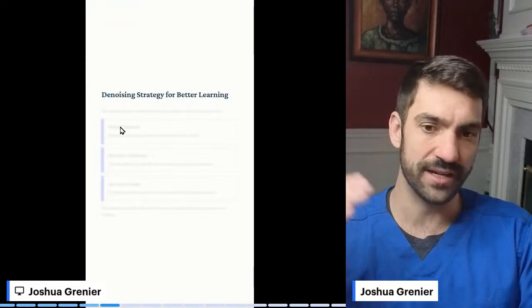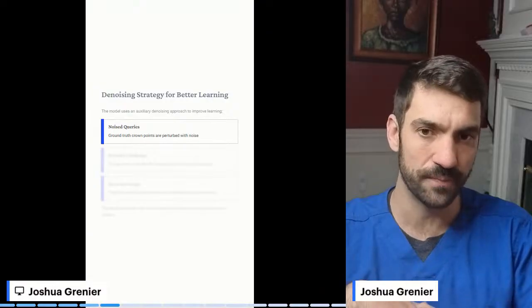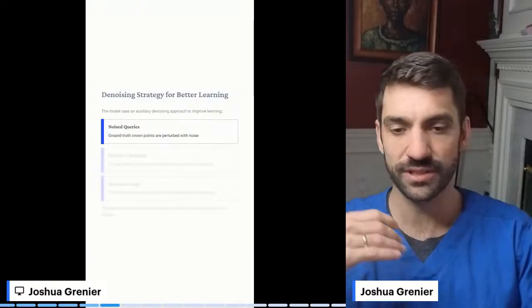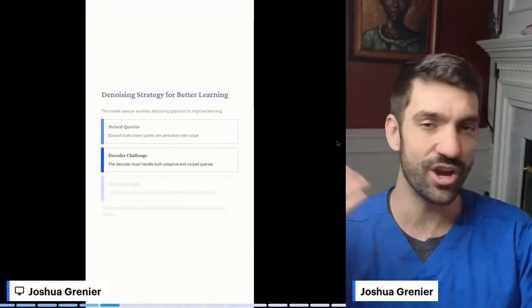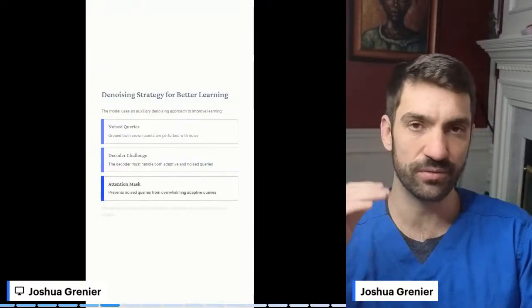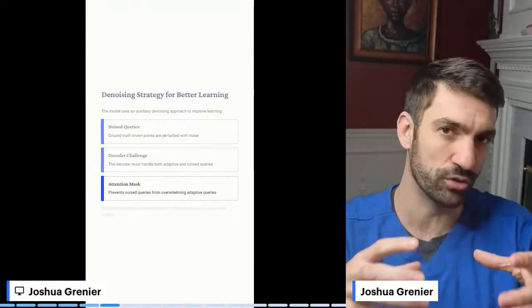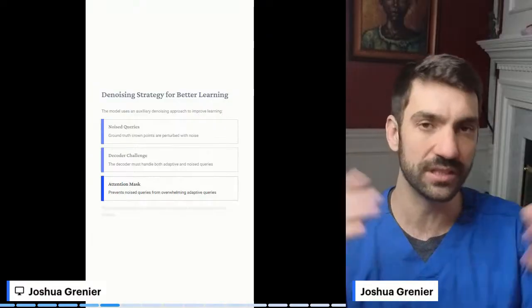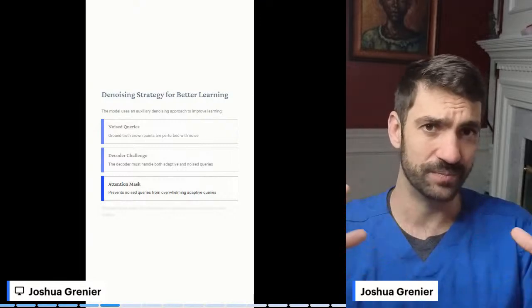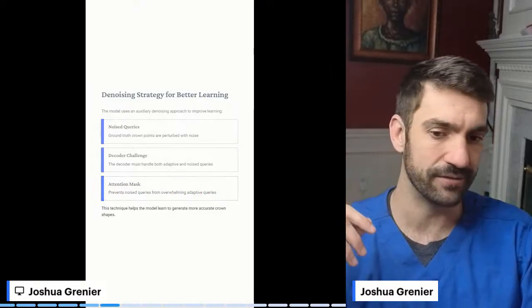And there's a lot of other strategies too, where they try to not only have a limited data set. That's the problem with this. Even though it was open source, the problem was getting good data. So they used various options where they added noise to the crowns just to try to increase the amount of learning. If you only train it on just a few, it'll essentially just memorize what those crowns are. And when you give it something new, it'll give you something crazy. So that is really the problem. They use various tricks to try to increase and stretch out and thin out the amount of data they actually have.